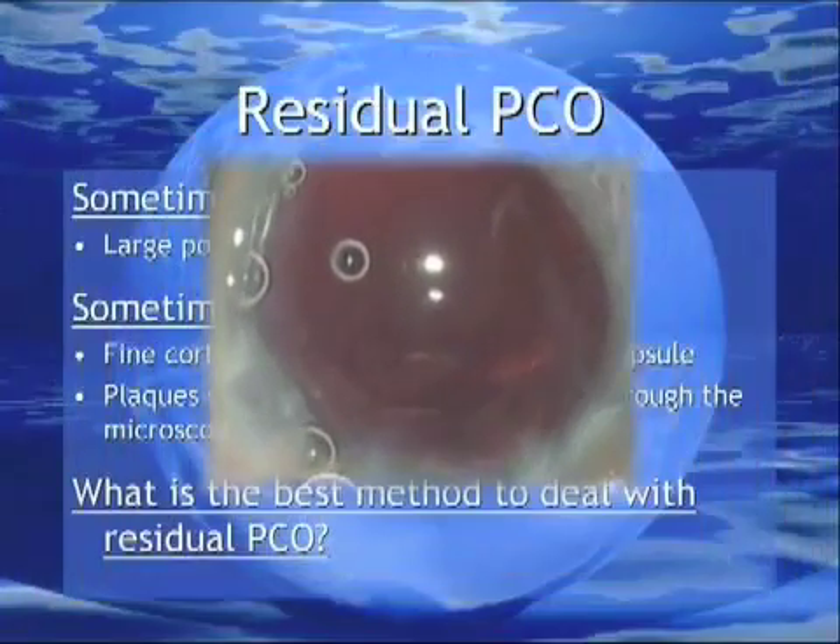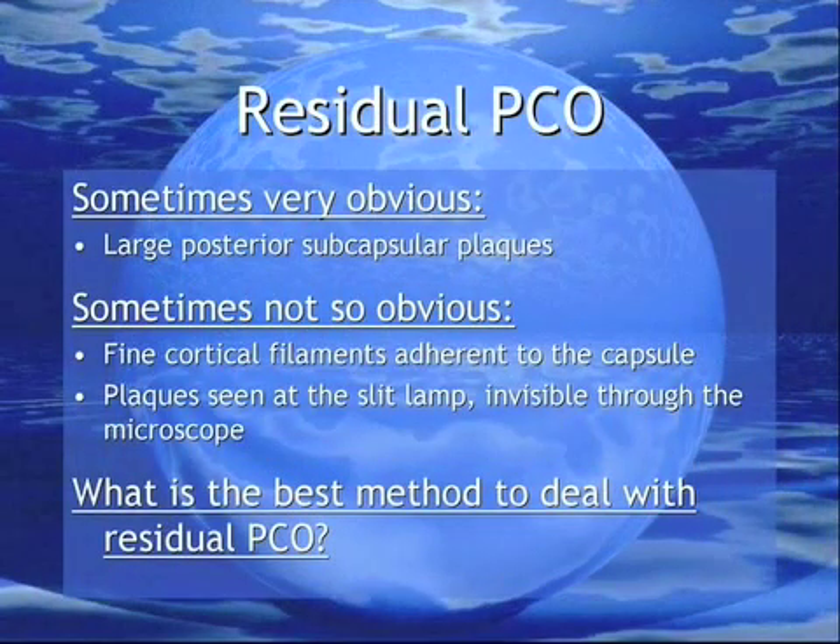As in this example, some residual capsule opacification is clearly evident, but many times this may be as simple as adherent cortical fibers, or a plaque visible at the slit lamp but invisible at the operating microscope. What is the best method for dealing with residual PCO?